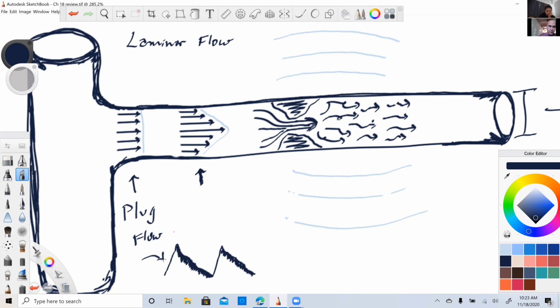And the next one, of course, is parabolic flow. Parabola. And of course, why does that happen? Friction. We can see this in our color imaging.